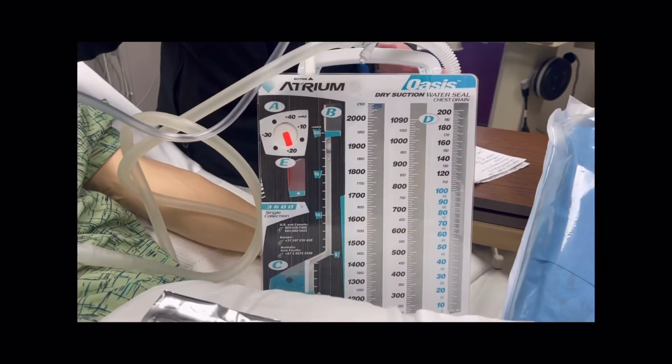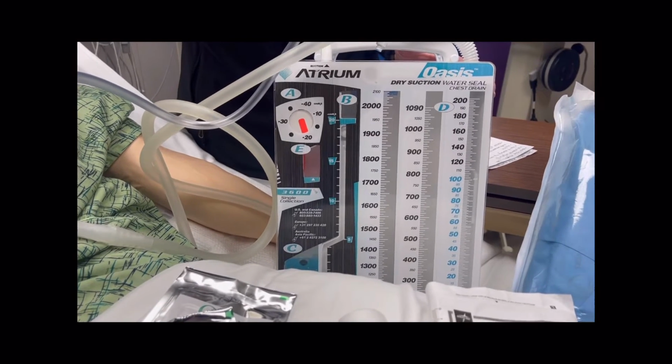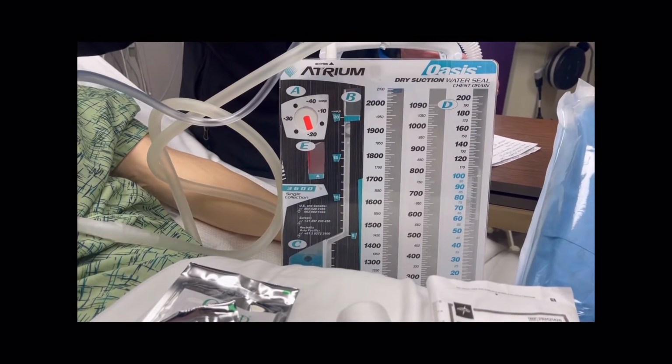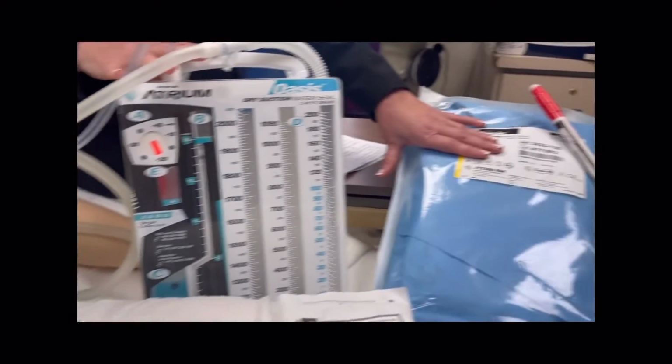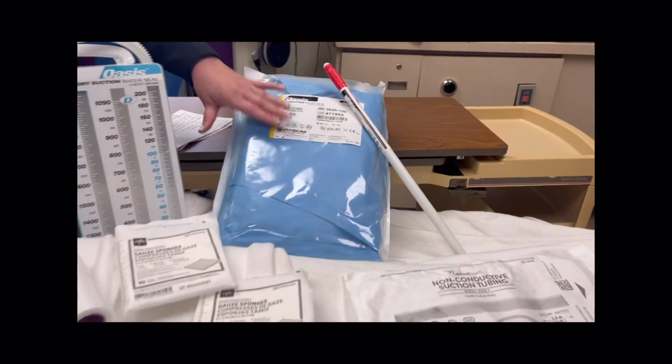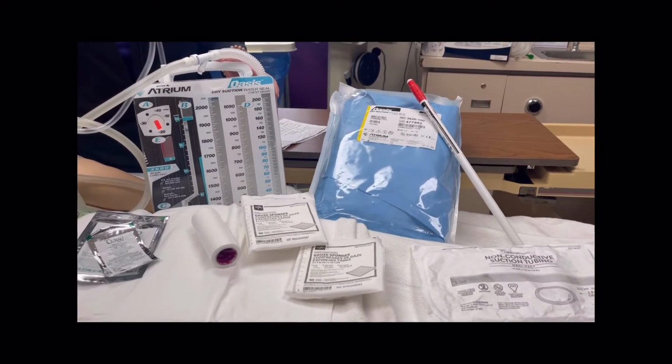If it's still leaking and we're still having an issue, our provider may end up having to place a second chest tube. If he or she is going to place a second chest tube, you want to go ahead and have another chest tube set up and the drainage, all of your supplies for another whole setup at the bedside.